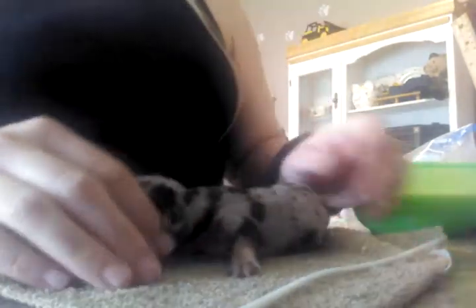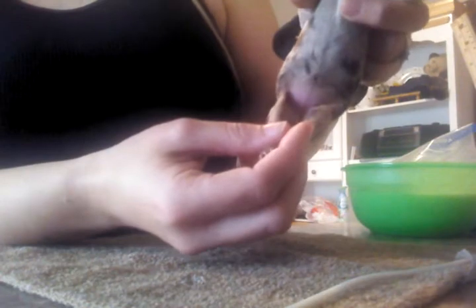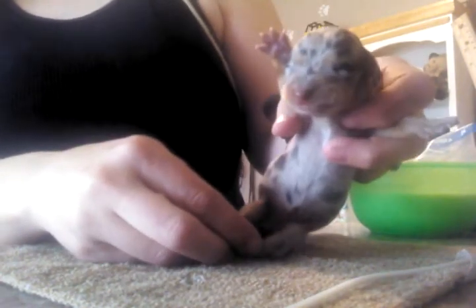You might have some residue in her mouth — you want to clean that off. You want to stimulate her like her mom would: lick her, stimulate her, shake her around a little. Right now she's cold, so she needs to go back in the warmer. But hopefully within an hour or so she'll start feeling a lot better. And look at that belly — see the pouch here? It's nice and full. So we know we got that into the belly, and she's a happy puppy.